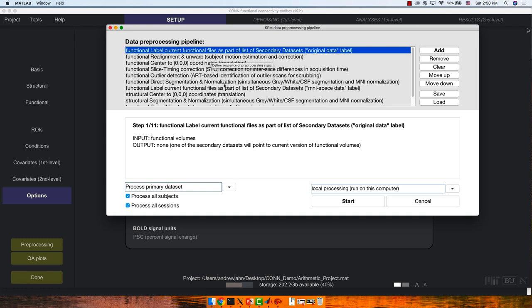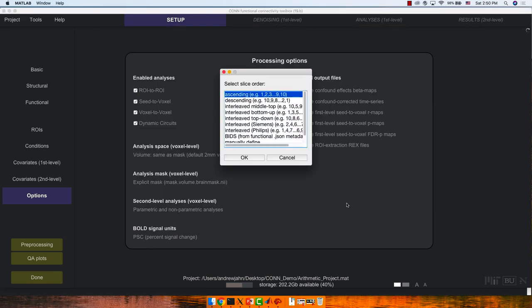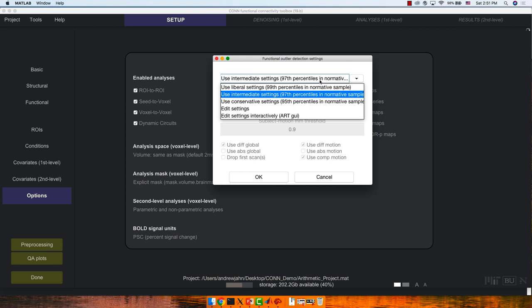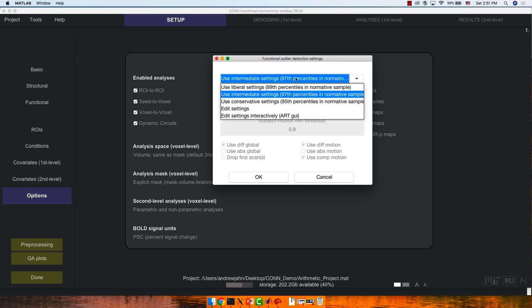The outlier detection settings are about flagging problem volumes that we want to scrub. The defaults say to create a distribution and remove a certain percentile of them. If you want to do this manually, go to Edit Settings — for example, if all the individual voxels have been z-scored relative to the global signal and there's an individual volume that's five z-scores above the mean, even if that subject didn't move, this could indicate a scanner spike. If it's a big problem, you might want to lower this threshold to four.